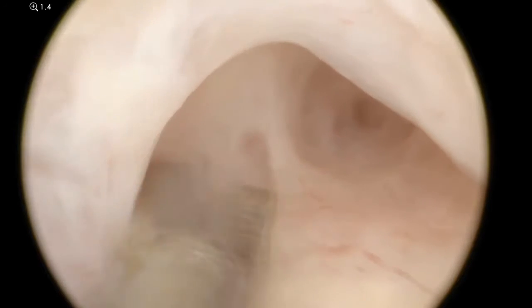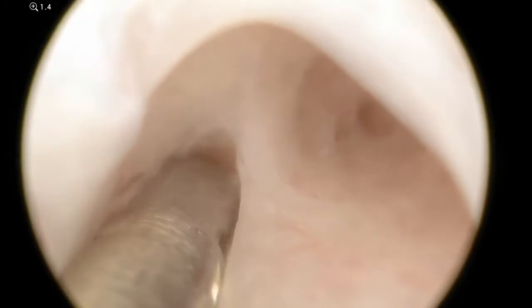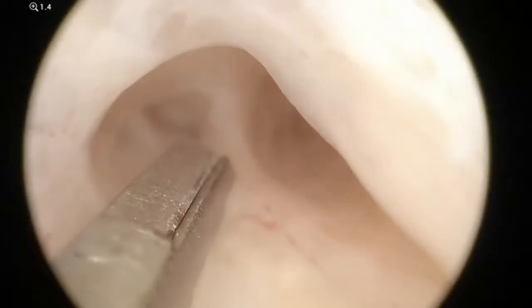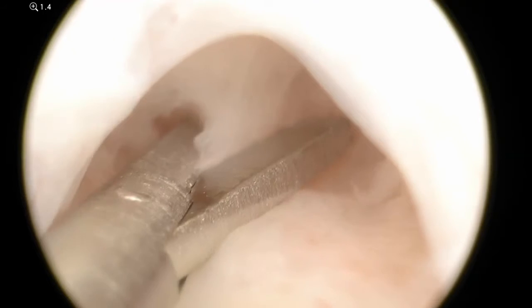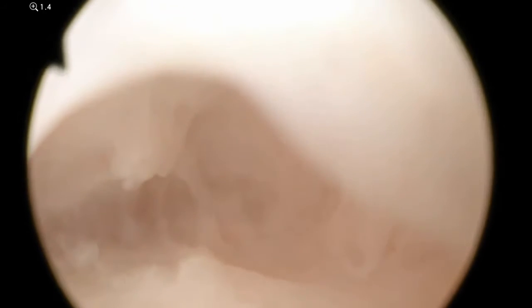Our preferred approach is to use a 5.5mm operative hysteroscope and a combination of scissors and graspers. This is preferred over the use of electrosurgery to minimize injury to existing endometrium. In this case, a blind end cavity is encountered. Scissors are used to interrogate the tissue, followed by a push-spread-cut series of movements.